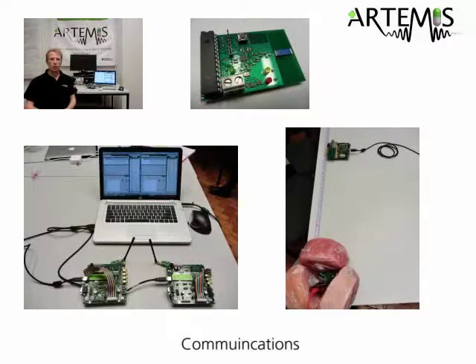Measurements with the prototype PCB have shown that the communication link works reliably through porcine tissue at a distance below 2 meters, which covers the scenario of having the capsule inside the body and the base station body-worn. For the lowest output power level of -30 dBm, the power consumption for the wireless transceiver chip is approximately 40 milliwatts.